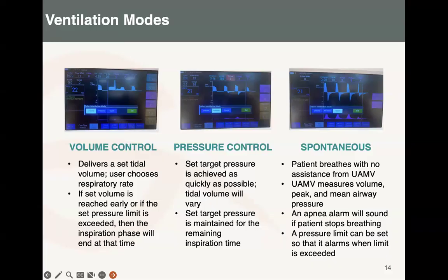It's going to give a high or low volume until you readjust your parameters and then you move on. But remember you have to set some few other parameters which are going to be discussed later on, like the respiratory rate, the IE ratio, and the PEEP. On this vent, you can also set the PEEP, okay?